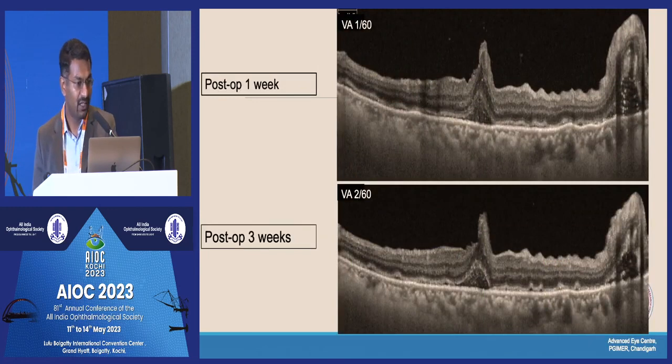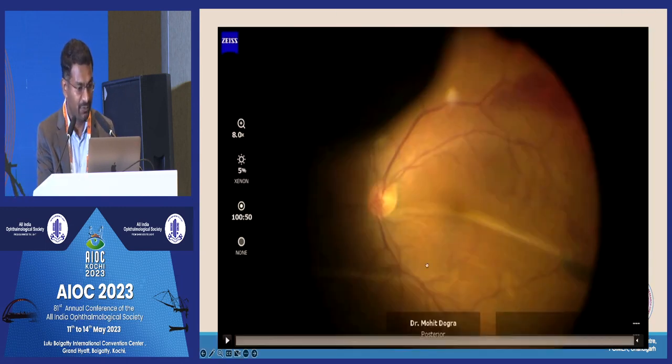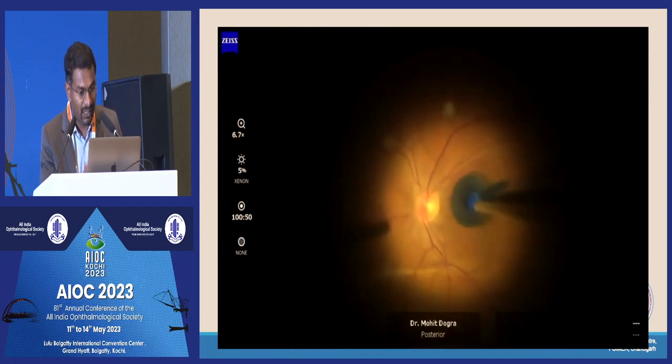We waited for about 4 weeks, but still the full thickness retinal fold didn't resolve on its own. Hence we took her for surgery. In this surgical video, I'm going to show you. In this, we completed the vitrectomy.